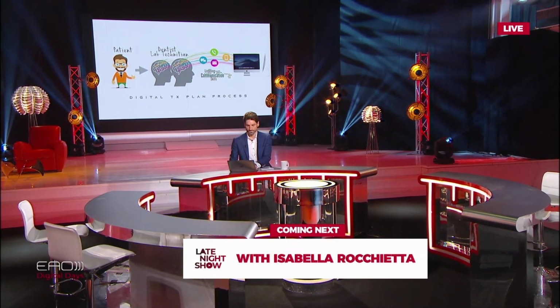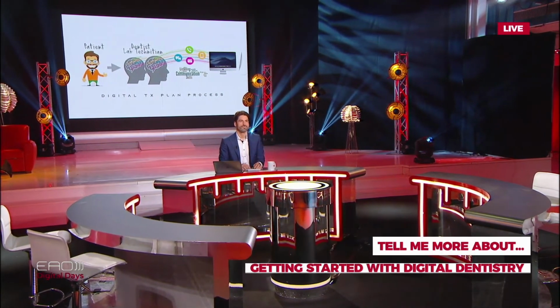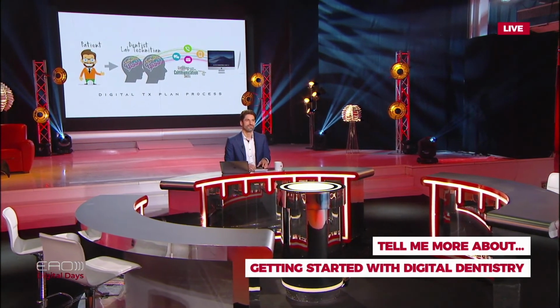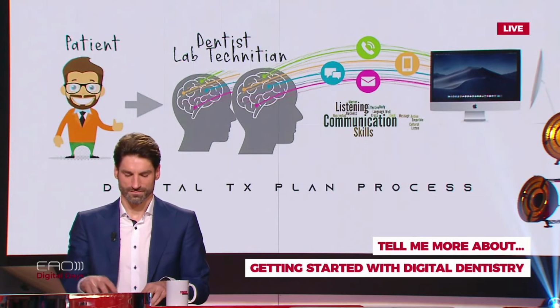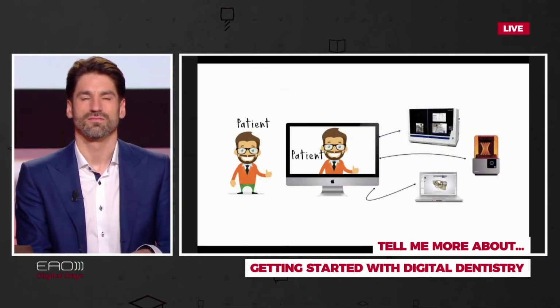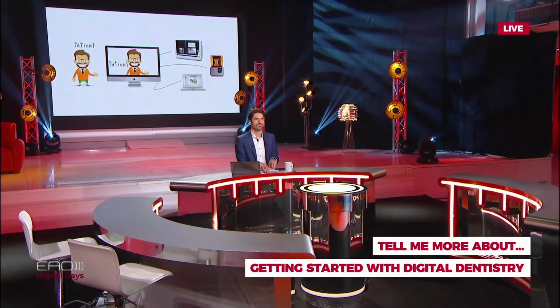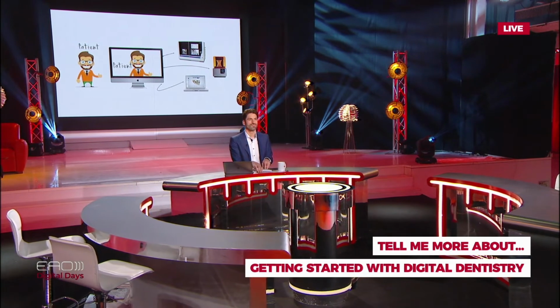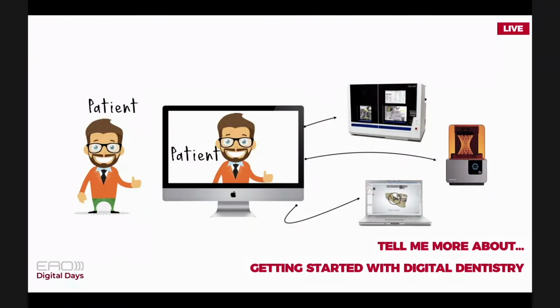So for me, the great advancement in treatment planning on these cases is that you now are sitting side by side with the prosthodontist, the oral surgeon, and the lab technician, giving information to a computer, and trying to digitalize the patient, trying to get to the virtual patient. And once you get to that virtual patient, then you start to send all that information to the different machinery that you need. If you're going to need a surgical guide, you send this to the 3D printer. If you need a CAD/CAM crown, then you send it to the CAD/CAM machine. So the idea is now that all the team is sitting side by side, sharing information.